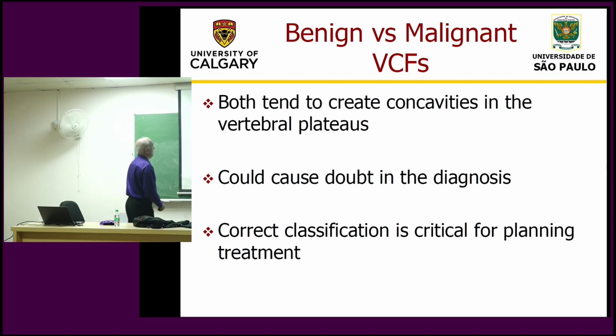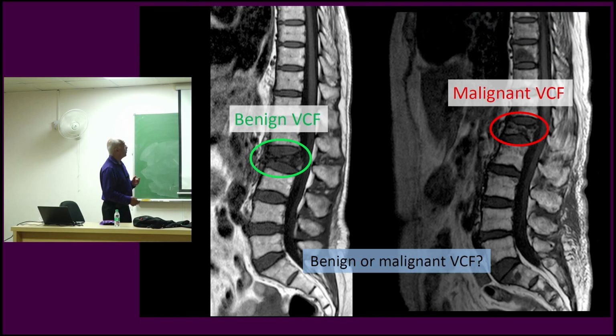So both malignant and benign cases tend to create concavities, and this could cause doubt in diagnosis, and correct classification is critical for planning treatment because the treatment is different for benign and malignant cases.